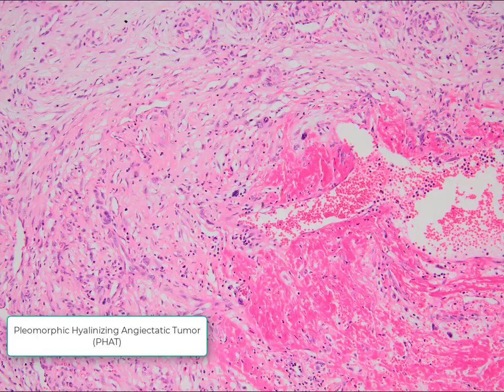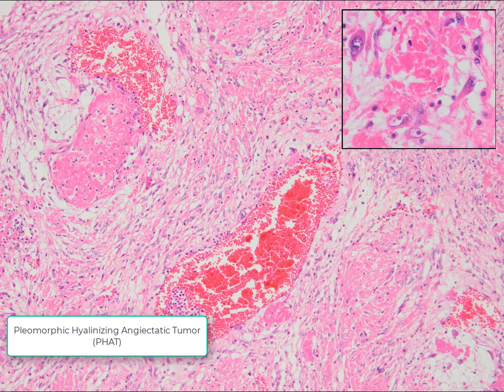Maybe in this case the most relevant differential diagnosis may be PHAT, pleomorphic hyalinizing angiectatic tumor, but the clinics and the location are not suitable, and S100 just resolves this diagnostic challenge. Thank you very much.